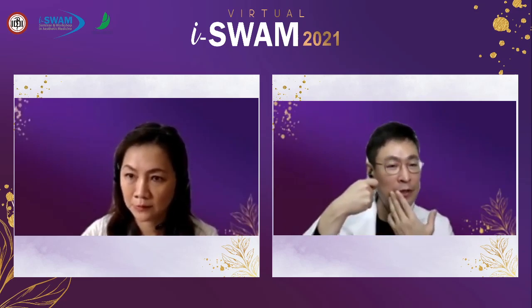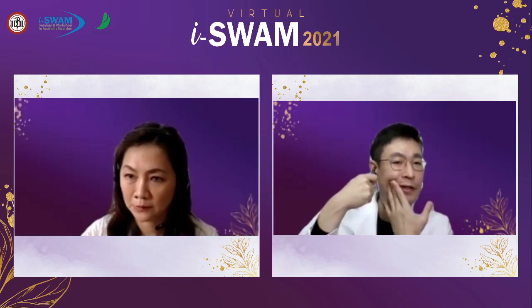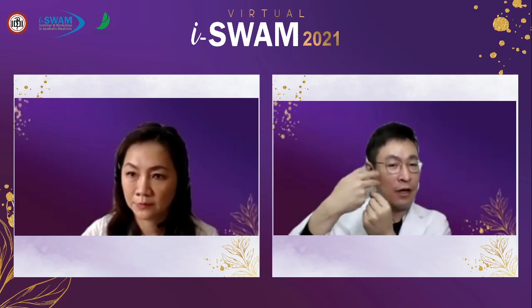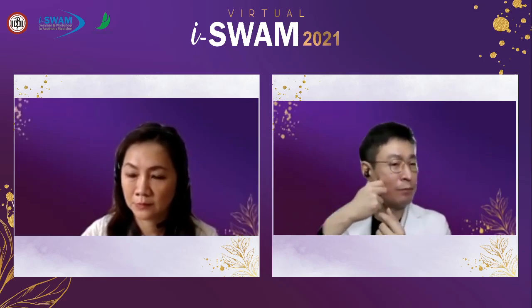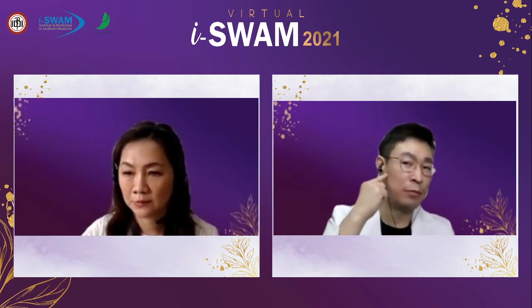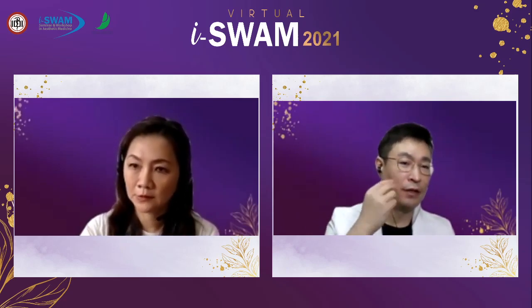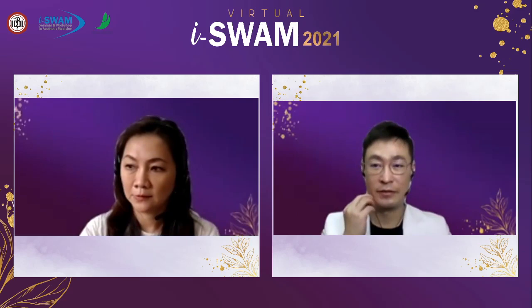There will probably be some dimple here, because the threads are pulled too much. And after cutting, the skin will be pulled, and the knot position will be a little beyond the entry point. And these dimples will be released.